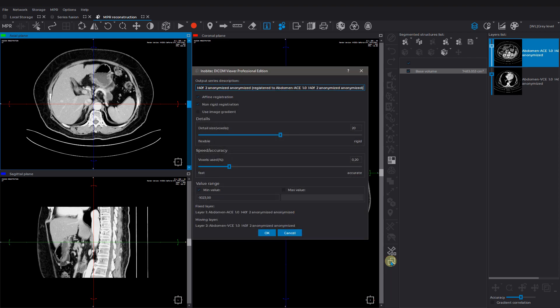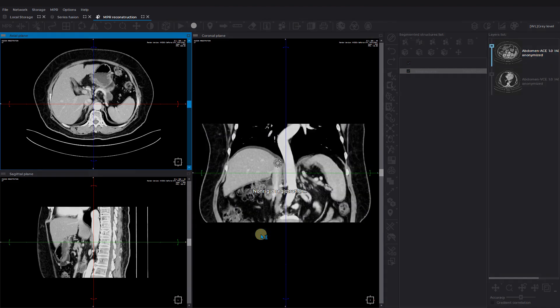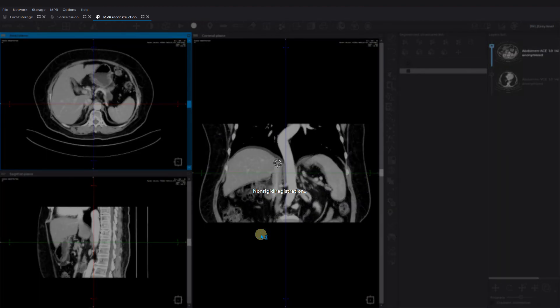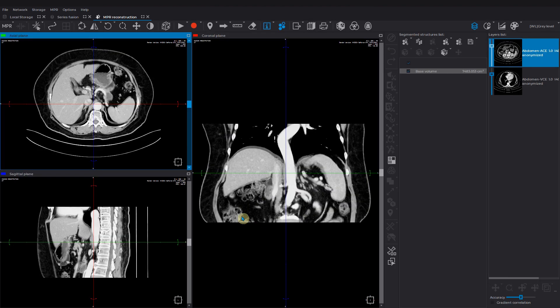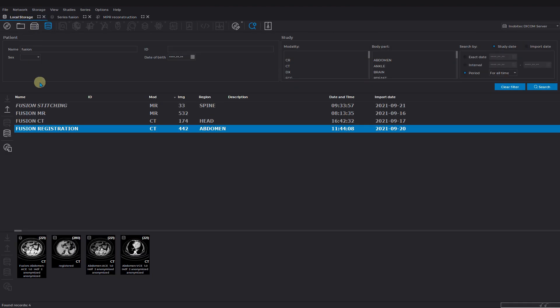Give a name to the new registered series and set up the parameters. Then you press OK and the volume registration is being carried out. After the process is done you can see the new series appeared in the local storage. You can open it as a regular study series.